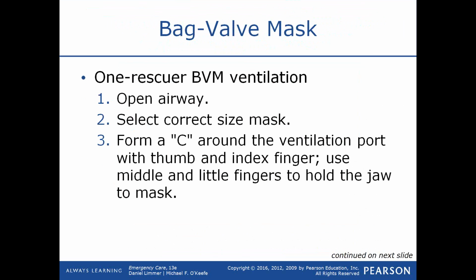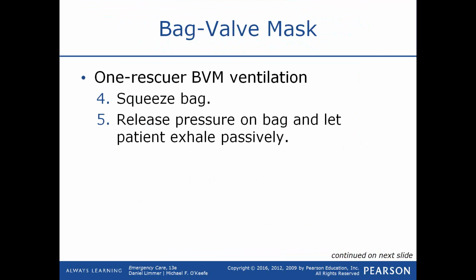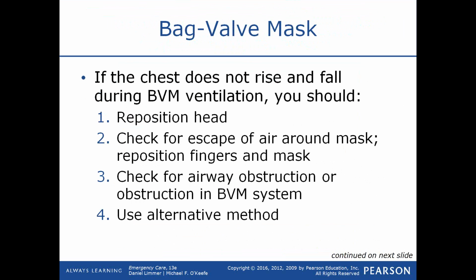With the one rescuer BVM, again, it's just not recommended, and I certainly wouldn't even practice it. There aren't many people that can do it correctly. Again, you may be able to do it in a lab. You may be able to do it off and on. But to do it each and every time you squeeze the bag to provide that minute volume, that's what's important here.